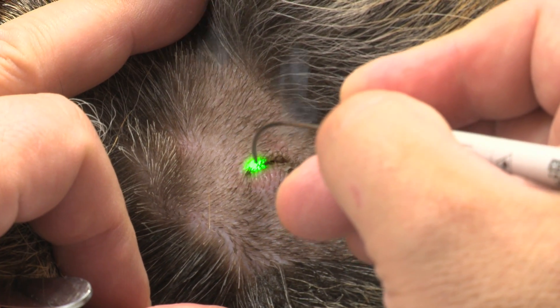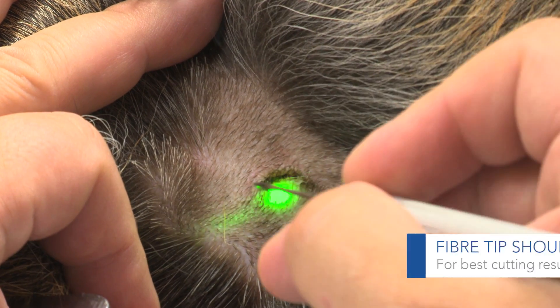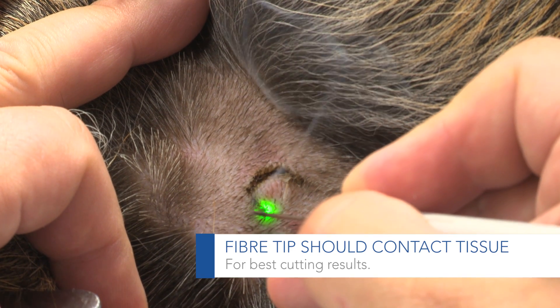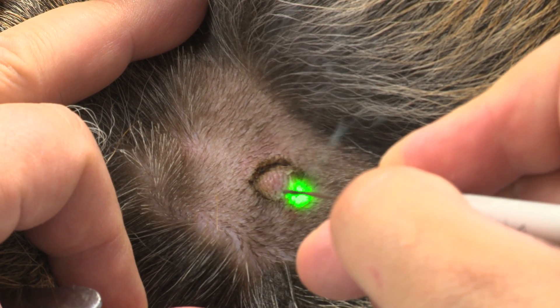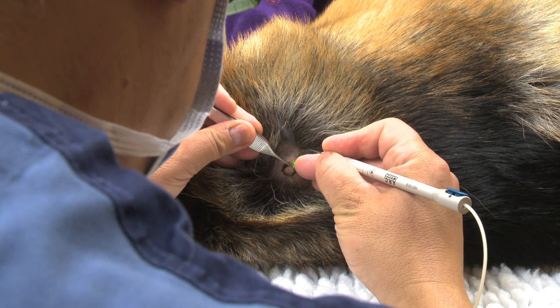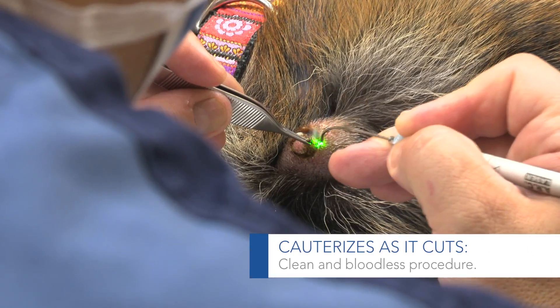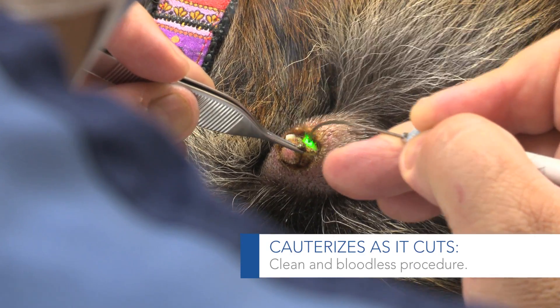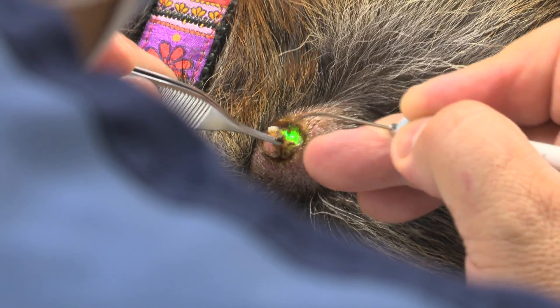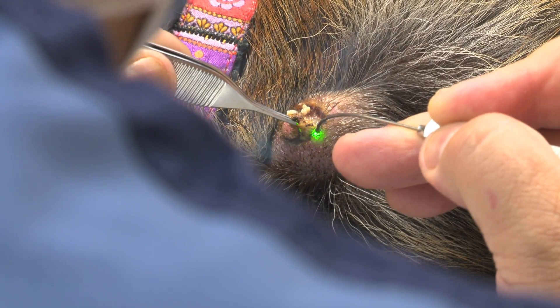Now we're going to resect this one as opposed to just ablating it. So I'm cutting the tissue just as I would with a scalpel, making a nice elliptical incision. Part of the cyst that I've been able to hang on to here, we're going to create some tension pulling all the time. So you're basically pulling and lasering, and it's the tension that actually gives you the improved cutting ability.